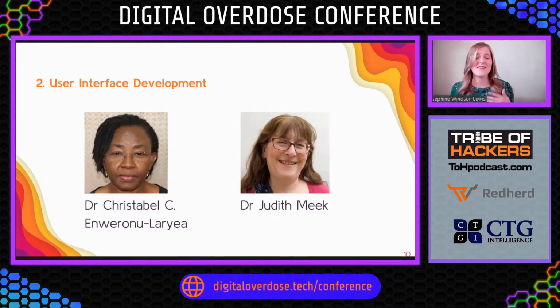If you're trying to take a picture and you make a click noise, they blink, they move, they're trying to hit the camera because they think it's a toy, make it silent. So I did. They also wanted something way more simple than what I'd put together. This is because they're dealing with a baby. And I don't know if you've ever interacted with a baby, they move a lot. And trying to take a clear image of the eye of a baby is really difficult. They need the app to be as simple as possible to help with this process.